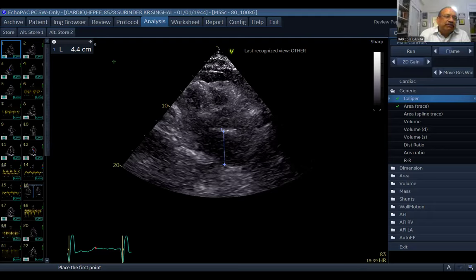It's a good question, because when people describe measurement, whatever we do today is being certified by cardiac MRI. So when we are doing something, we have to do something which is almost close to cardiac MRI. Of these two lengths, when we took the longer length, we were overestimating our LA volumes. When we took the shorter length, we were normalizing almost close to cardiac MRI.